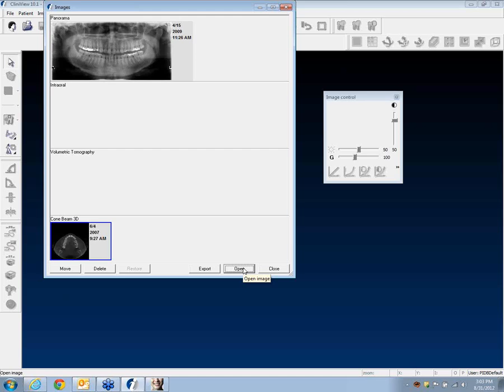But you also may find some implant manufacturers or surgical drill guide provider softwares also available, like Materialise's SimPlant or Nobel Biocare's NobelGuide, along with other kinds of software that fit into that 3D viewing type of spectrum.